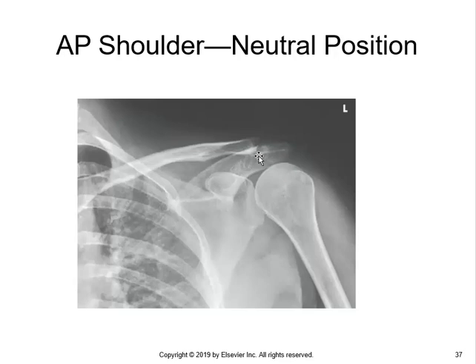So if there's a slight separation or slight deformity on one side compared to the other side, maybe this side drops down just a little bit, but a mirror image on the opposite shoulder looks more like this, then we could say that the patient has a level 1 separation. Level 4 separation is obvious. The clavicle is sticking up here, and the acromion is way down here somewhere.